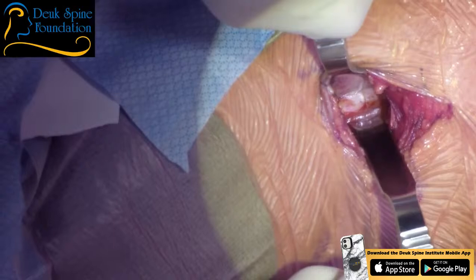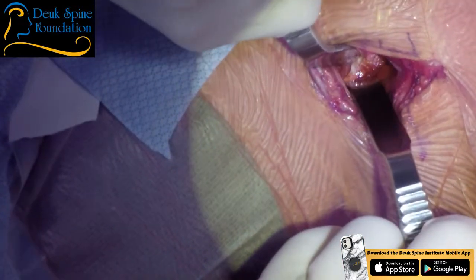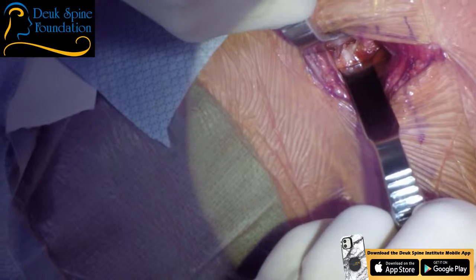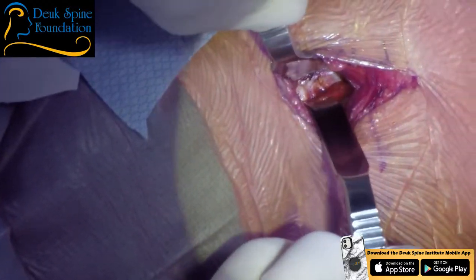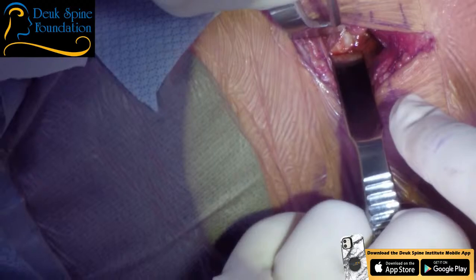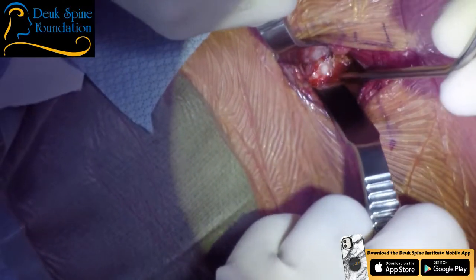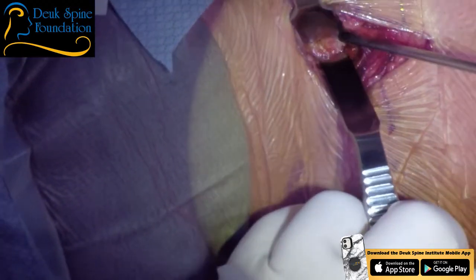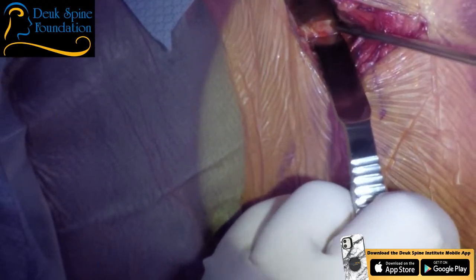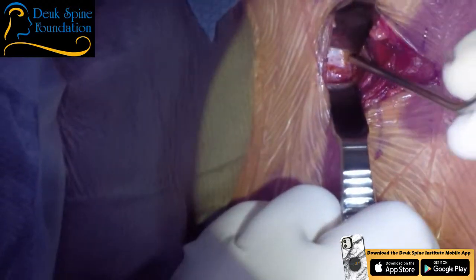All right, so again, very, very difficult situation. Let me see, 4-5. No. That's not the issue. Dr. Patel's doing a great job. No, that's 4-5 up there. See the hole in the disc right in the front? Let me have it. See this right here? That's 4-5. See it? That's the one we mark, 4-5. This has got to be the 5. Then 5-6. And then 6-7.